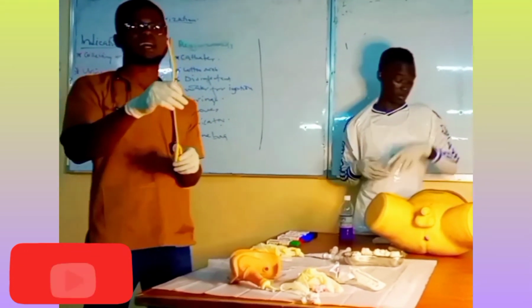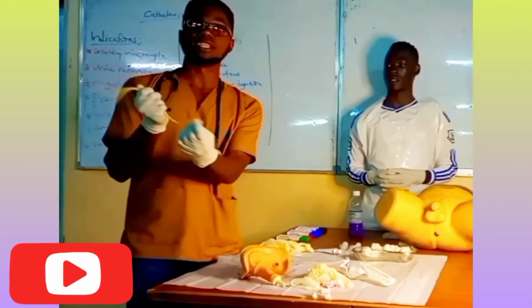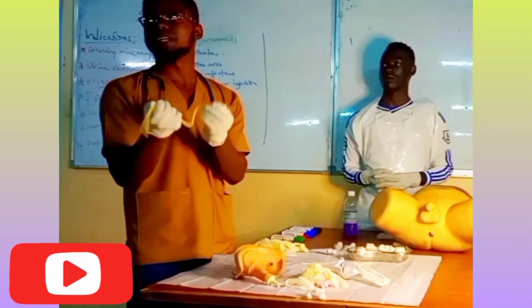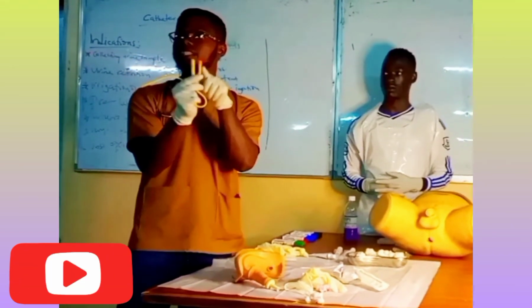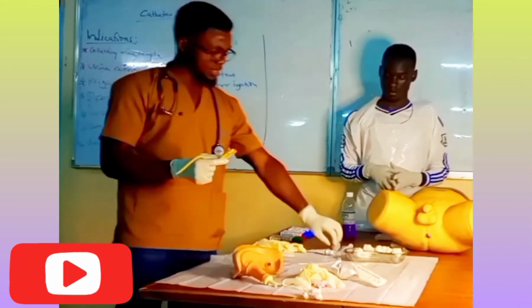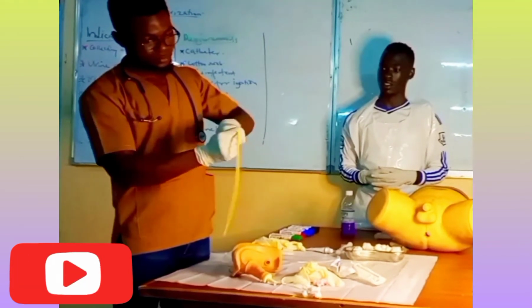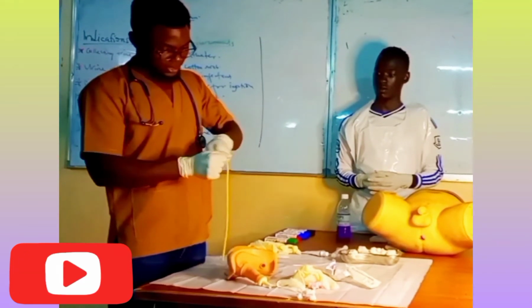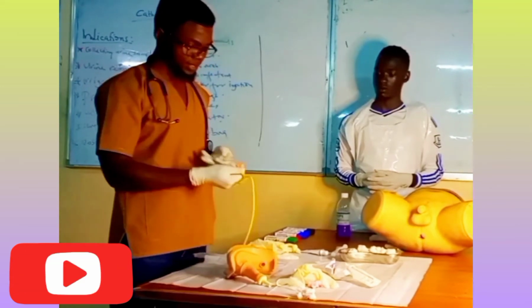We have put our catheter inside. We have inserted it inside the man, and we saw our first urine coming out. So that indicates that I'm successful. I'm inside the urinary bladder. Are we together? Then you see this part which has the orange cover. Normally it's red to orange. It is the inlet. So I'm going to get my water for injection. I put it on the inlet. Normally it has some resistance.